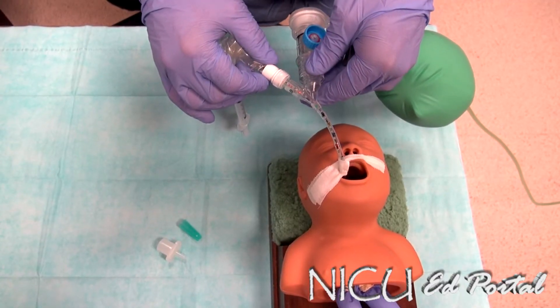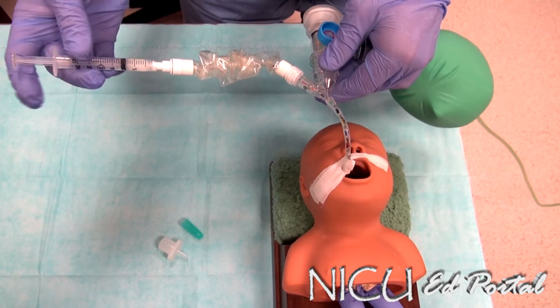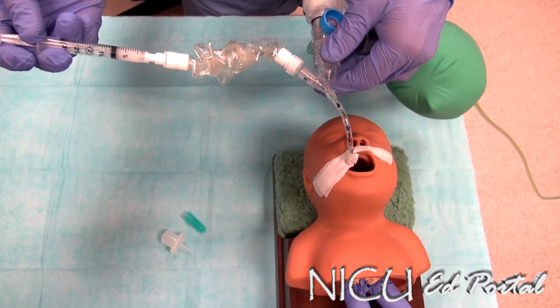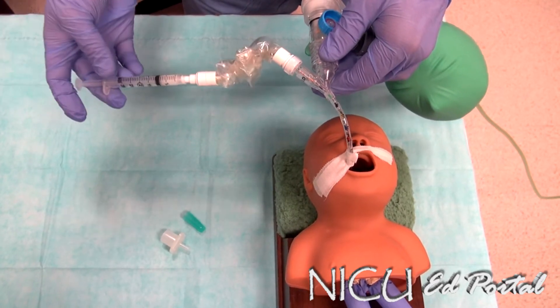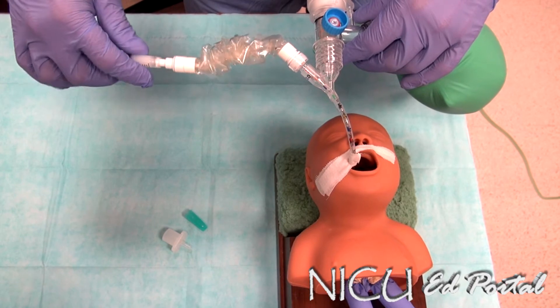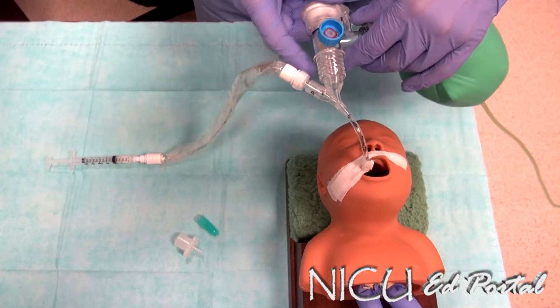From there, we take our aliquot or dose of surfactant and administer that over a period of a few seconds, ensuring that the surfactant does not come back up the tube. If it does, we will continue to bag the patient through that procedure. As you finish administering the dose of surfactant, remove the catheter and then resume normal bagging.